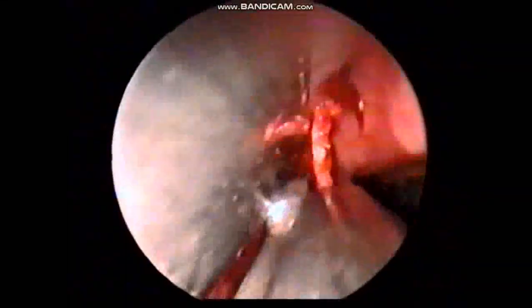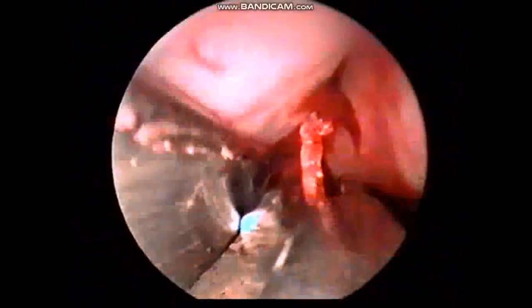The bony septum. The patient is comfortably sleeping even when you are doing this procedure, because we have given 75 milligram of injection pethidine intravenously. That is the vomer.